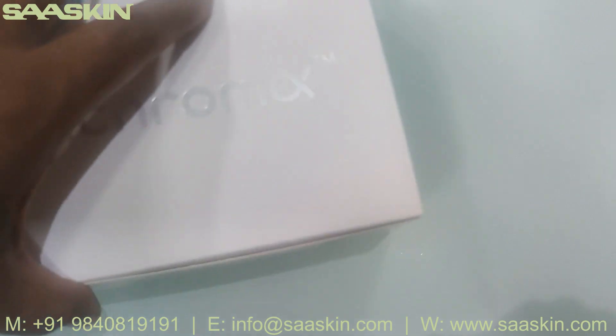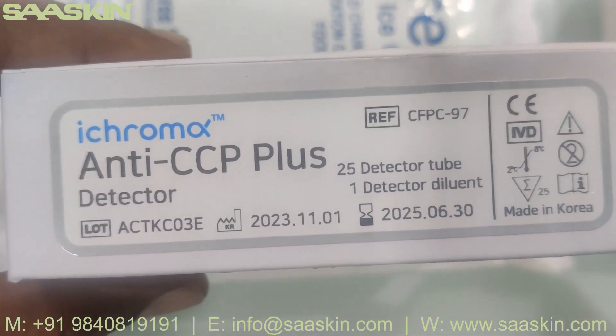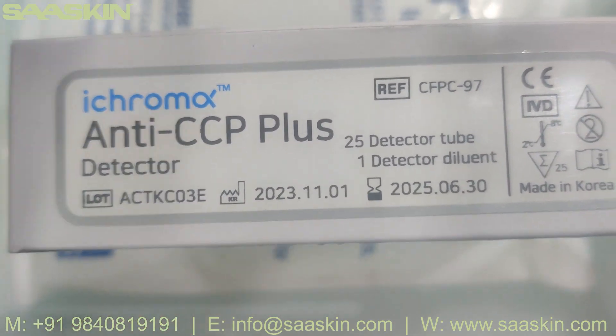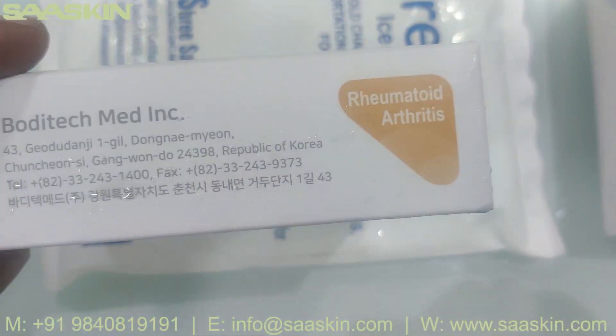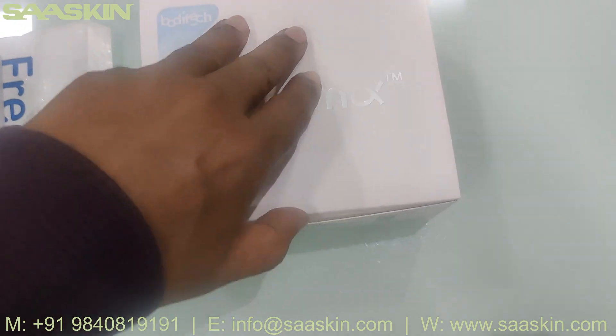You can see the reference part number here, and also the Anti-CCP Plus detector buffer, which comes separately. Let me open this for you.